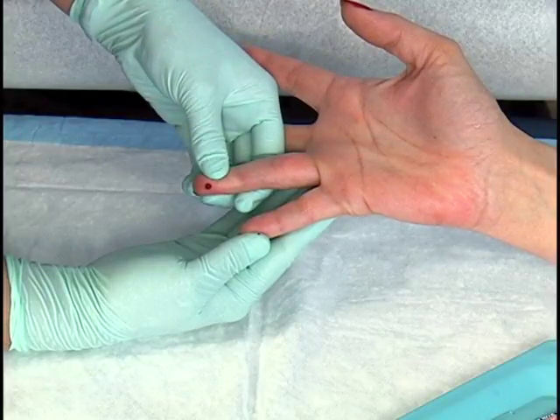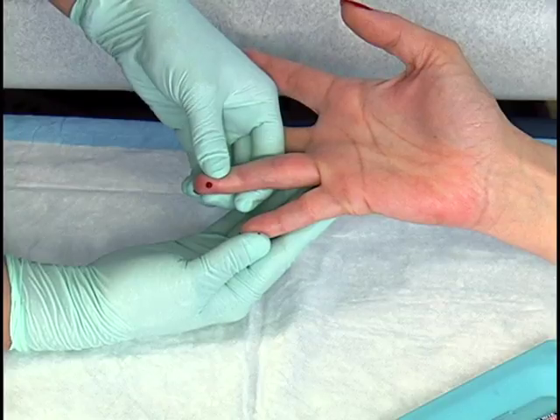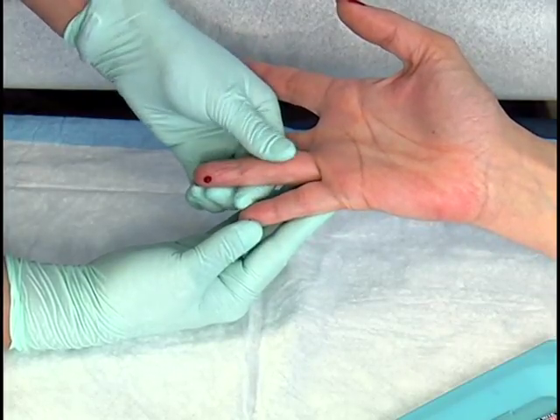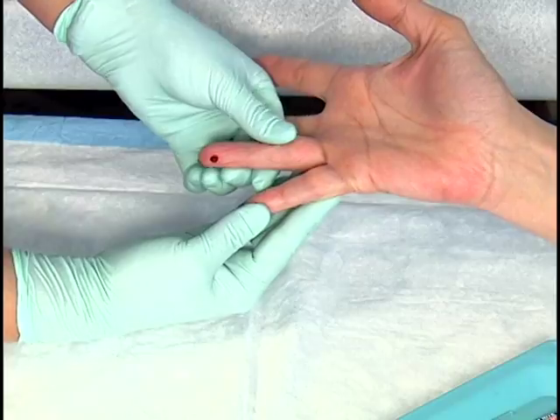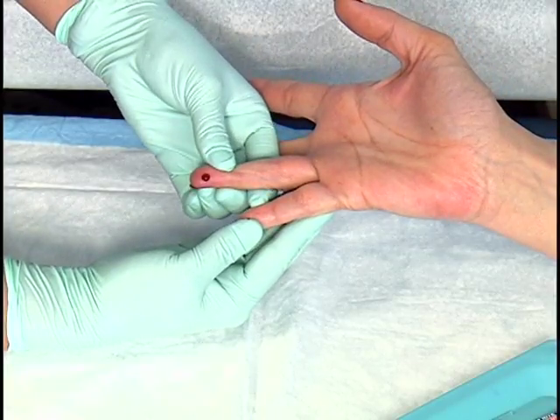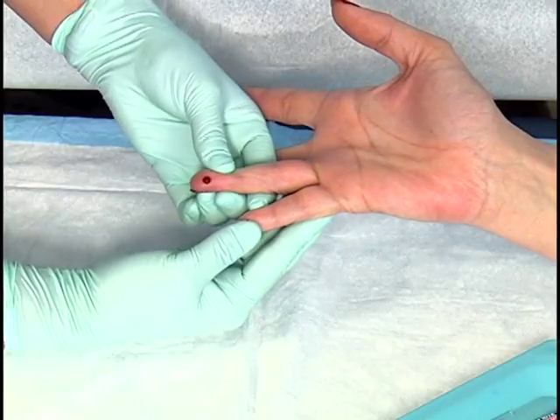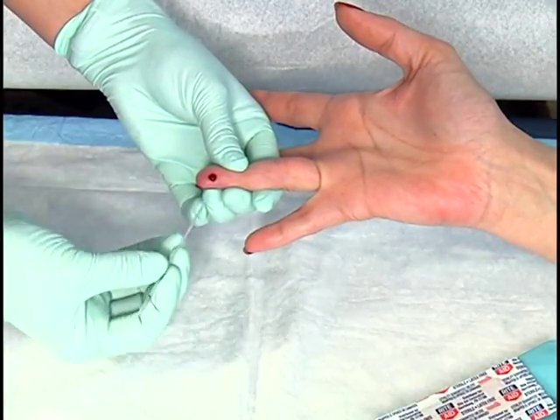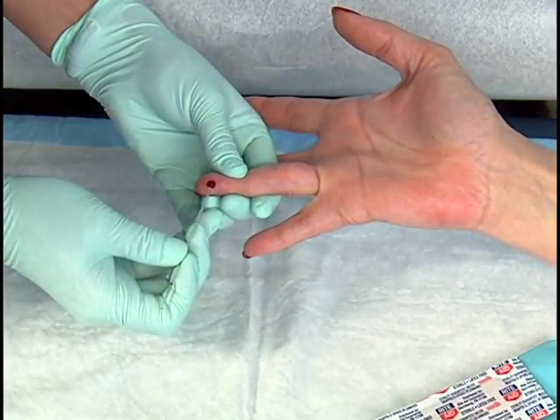Allow a large, well-rounded drop of blood to form. Apply gentle, continuous pressure without squeezing the finger. You can massage the tissue surrounding the puncture firmly but gently to encourage blood flow. Squeezing or massaging the site excessively causes dilution of the blood sample with tissue fluid, leading to inaccurate test results. Collect the blood specimen. This specimen is being collected for a hematocrit determination.